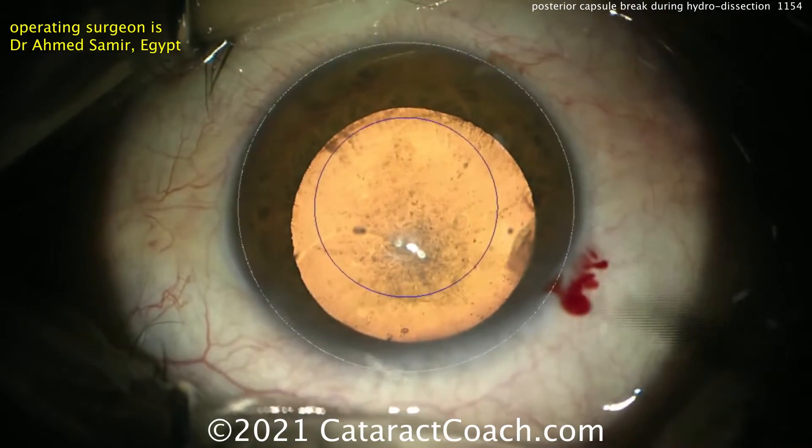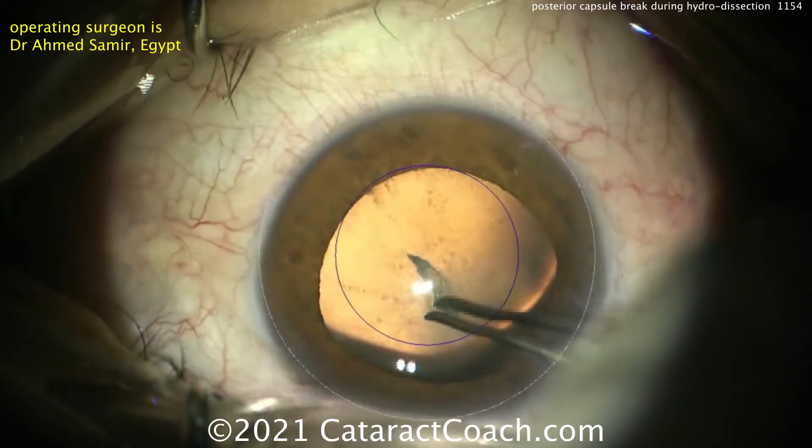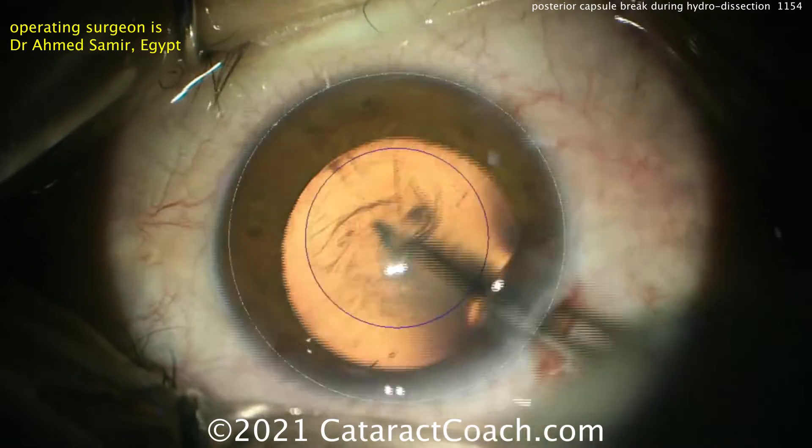This is using a microscope that has an overlay to give you an idea of where to make the capsulorexis. Starting off here with just the forceps and following that guide, he can create a very nice capsulorexis.